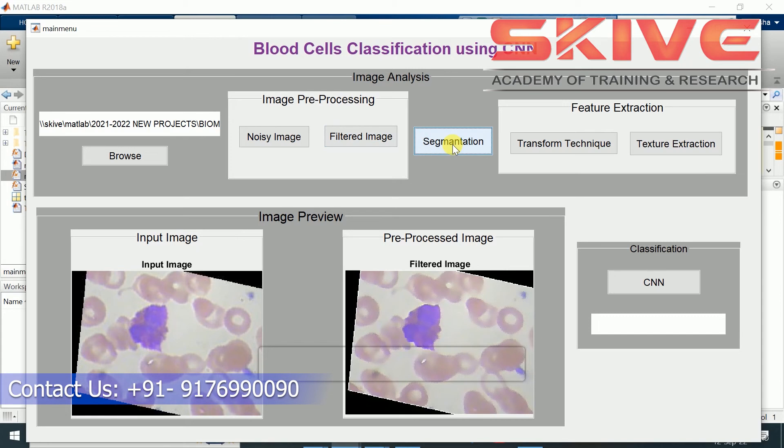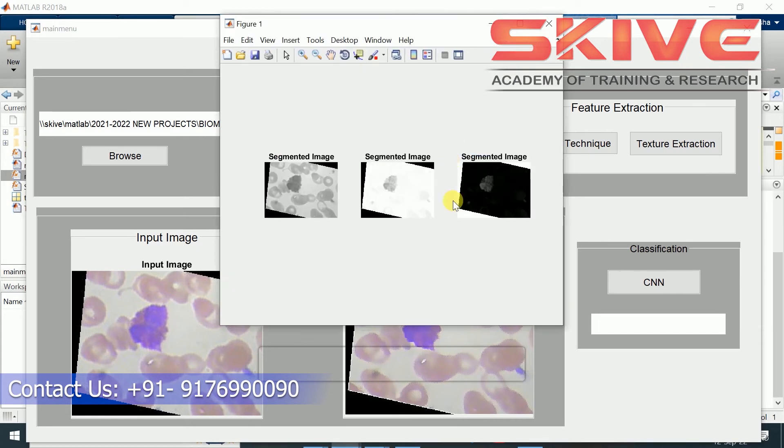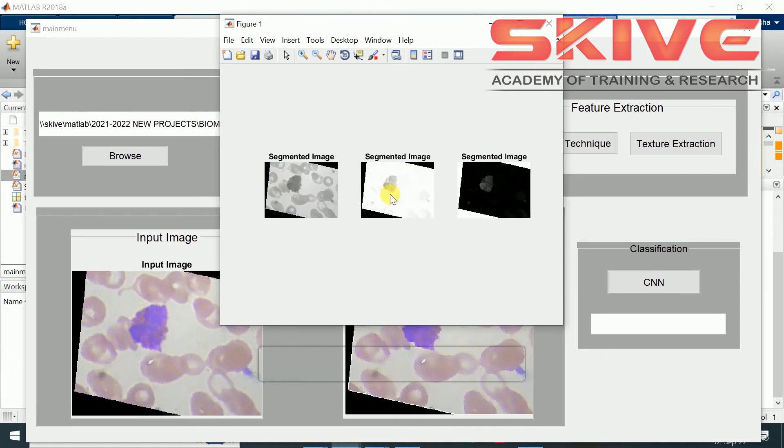The segmentation process will be applied for segmenting the blood cells. We can see the differences.